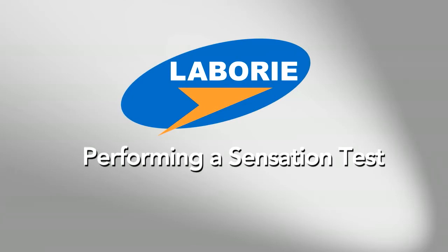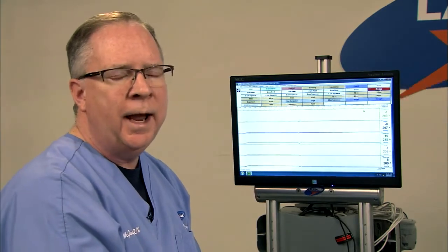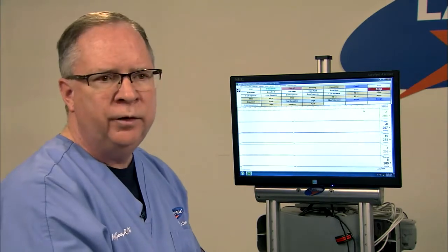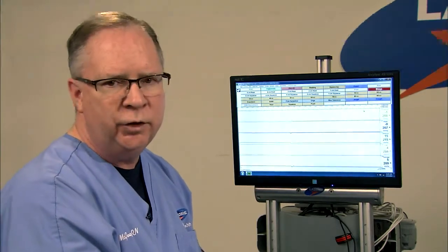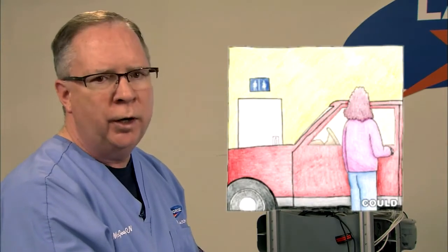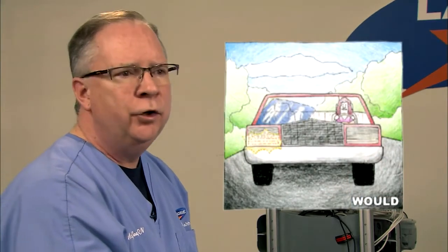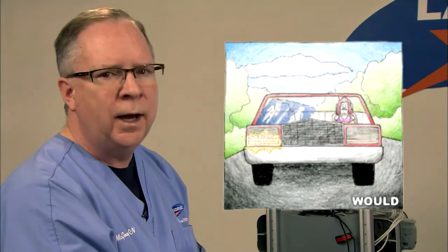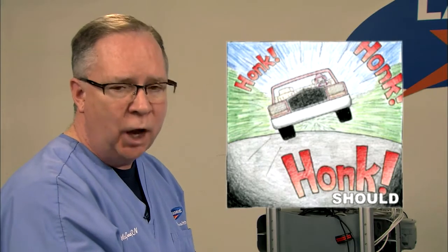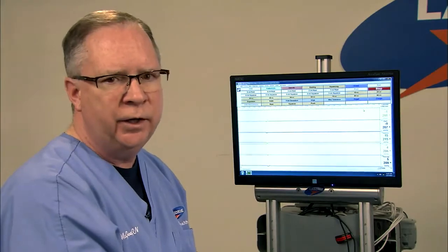Measuring the sensations is the next portion of the test. This will be done by injecting air into the rectal balloon and asking the patient what sensations they feel. The three sensations are defined simply. The first one is the first sensation. We want to know when they first feel like they're starting to fill up, like there's something going on in the rectum. The next sensation is urgency, when they have an urgency or a desire, when they would normally get up to go have a bowel movement. And then we're going to get to the point where they have their maximum tolerance. We want to fill their rectum until they have a strong desire to have a defecation.